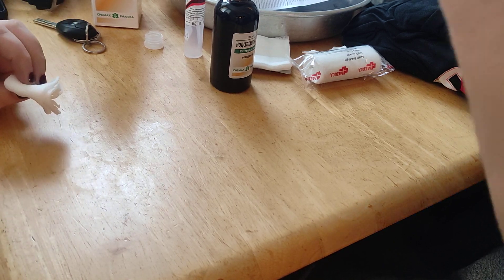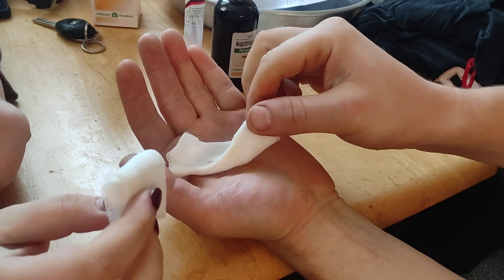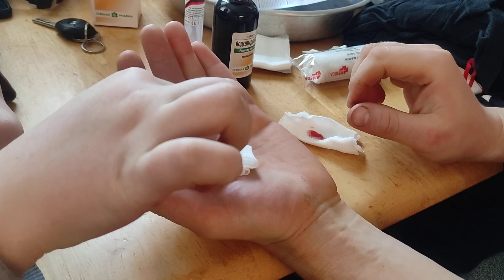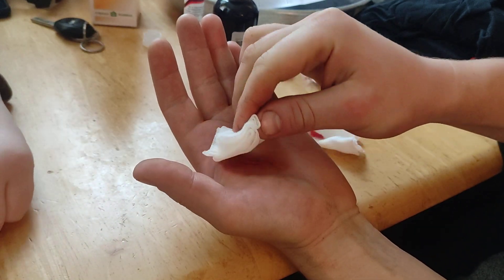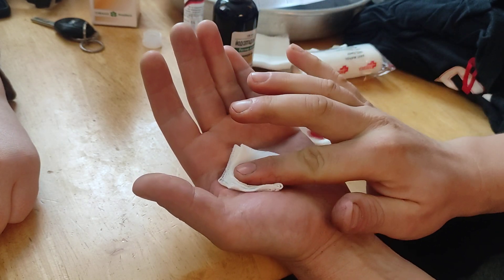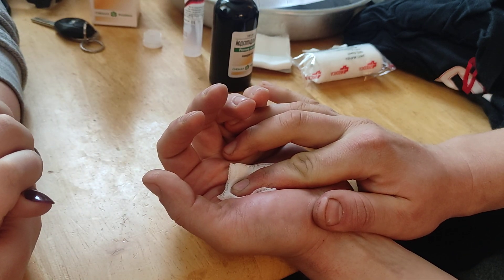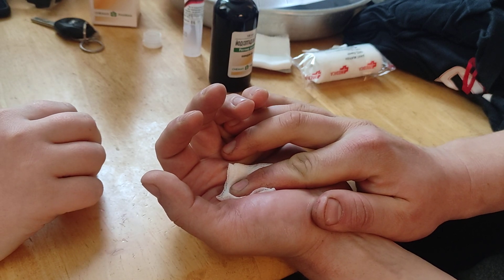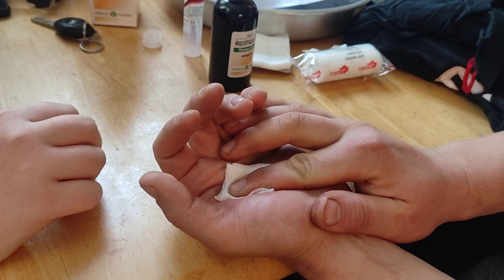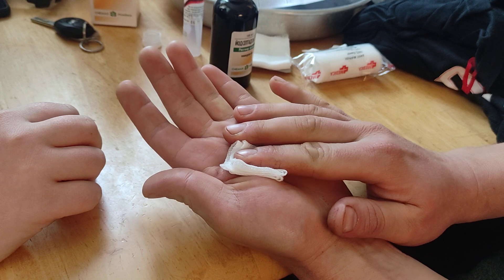About 20 minutes later, let's see if there's blood coming out again — yes, we do. It's not good. Another 20 minutes after that, we will try with the ER. We can't glue it if it's leaking. It was stopped the first time. Let's start again.